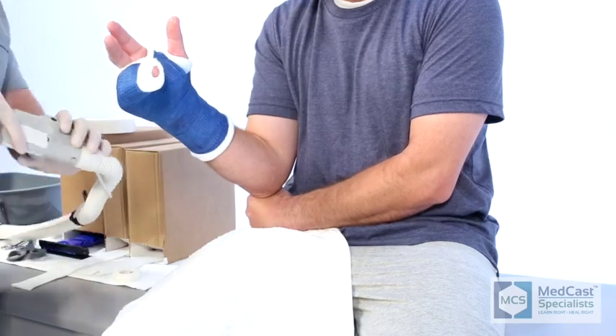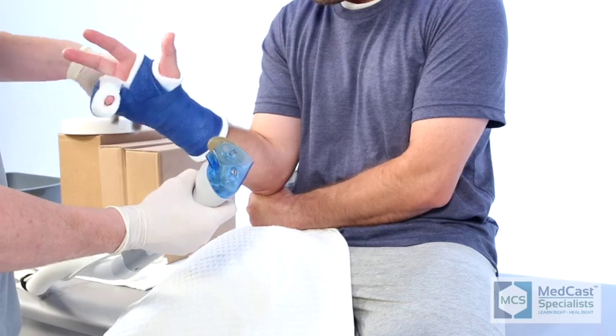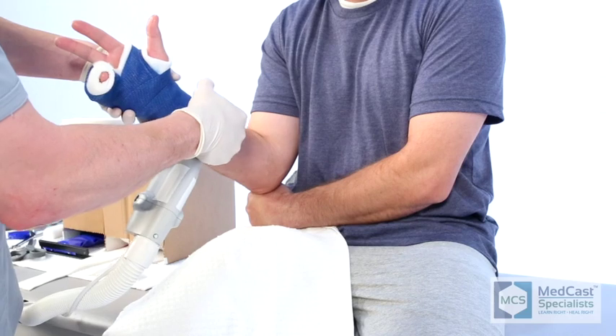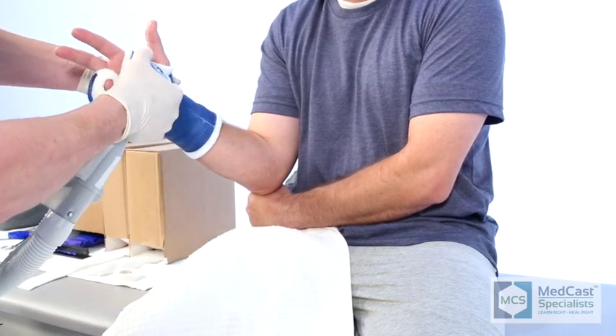Cutting an ulnar gutter cast off is a lot easier than people make it out to be. Use the same technique as a short arm cast, and keep in mind the splint material you may have included — make sure you don't cut through that, as it will make for harder cast removal.